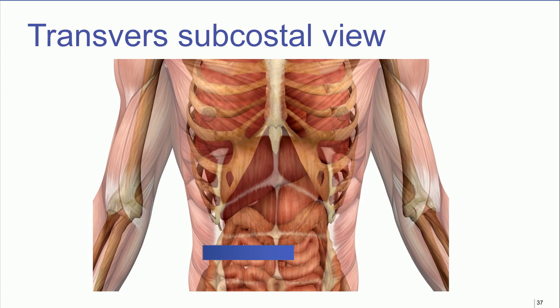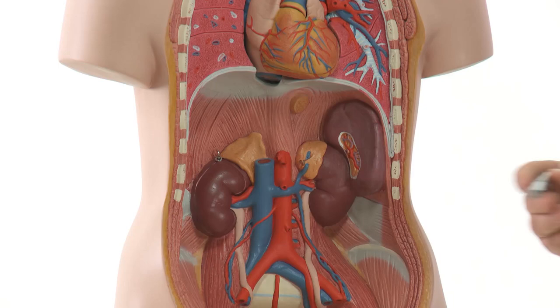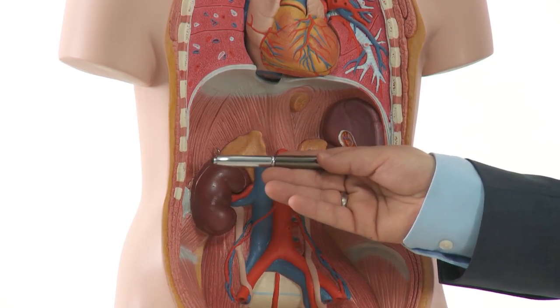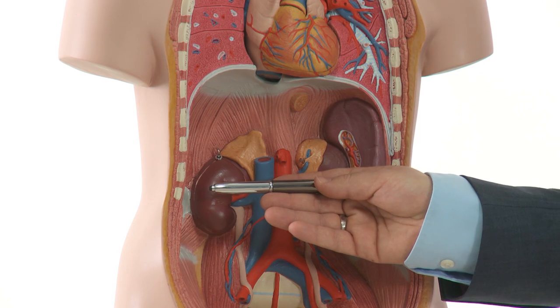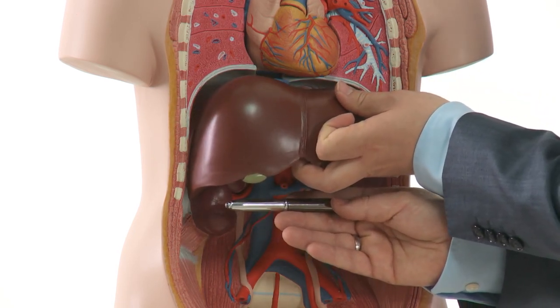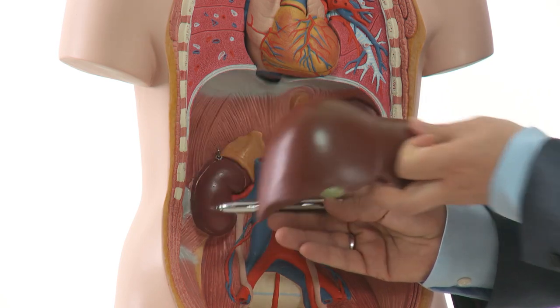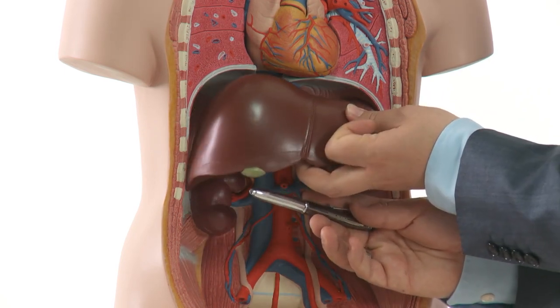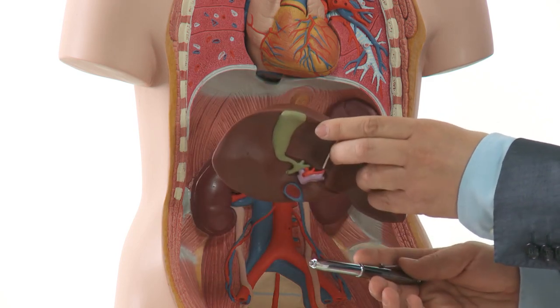The third approach to identify the gallbladder starts with scanning the right kidney in a transverse plane. I will show you on Hippocrates. It starts when we are scanning the right kidney in a transverse plane. While we do so, we find liver parenchyma in the right upper section on our screen. And when we scan the cranial pole of the right kidney, we will detect the gallbladder on our screen.